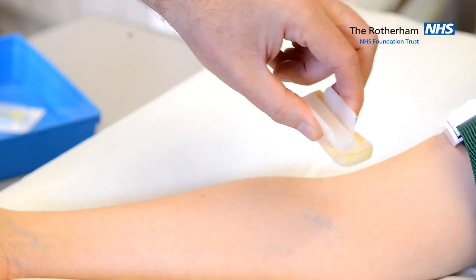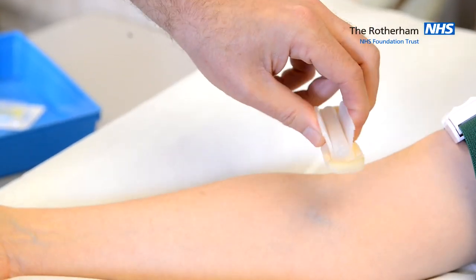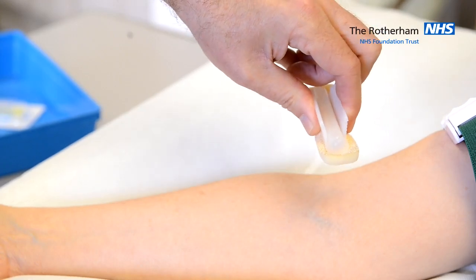We need to clean the skin for 30 seconds. To achieve this, we use the chlorhexidine and alcohol impregnated sponge.